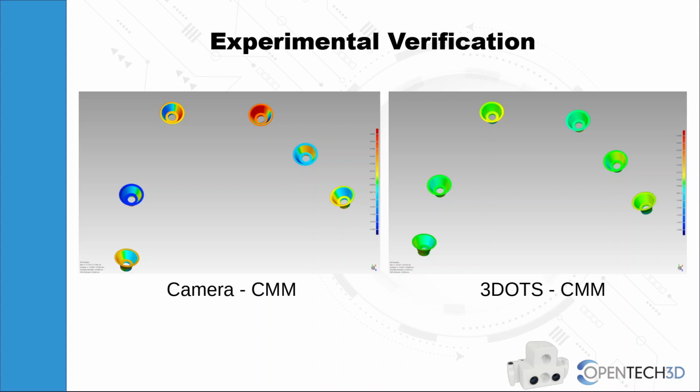Moreover, with photogrammetry, I always acquire the complete scene in just a few shots. While with the intraoral camera, to scan an entire arch, I have to acquire hundreds of individual scans that the software has to put together. So, in summary, if we could do the same test in the mouth, again, it's not possible because a coordinate measuring machine cannot work in the mouth, but if we could, we would end up with the image on the left related to the data provided by the intraoral camera much redder and much bluer, and the image on the right coming from photogrammetry with the same green.